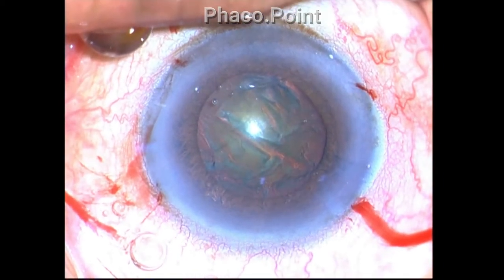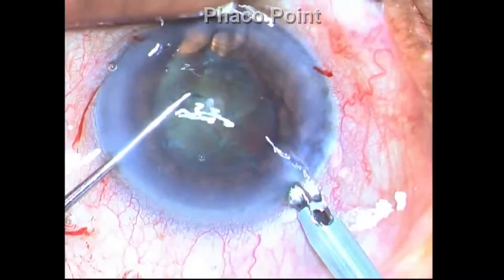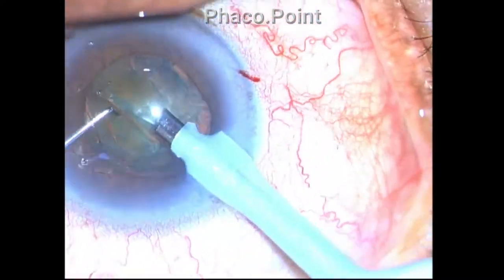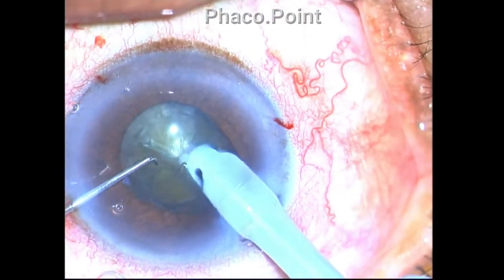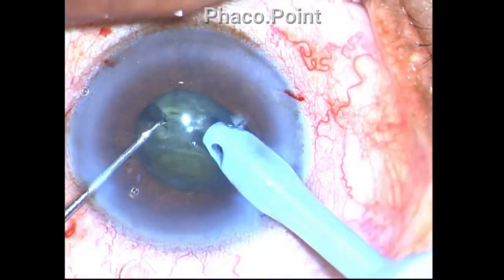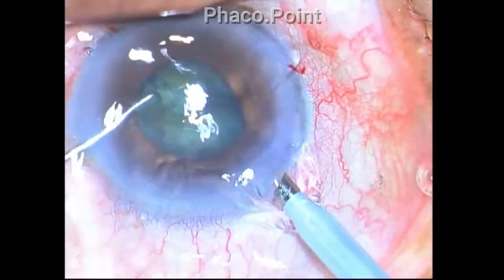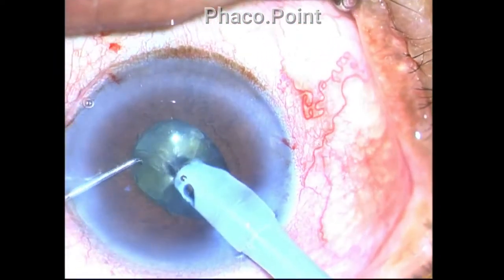Starting with nucleus disassembly — the incisions as well as the capsulorhexis were uneventful. I'm trying to break the nucleus down using the direct phaco chop technique, and even as I proceeded with the first chop I found that the pupil had dramatically shrunk in size from 5mm to about 3.5 millimeters.